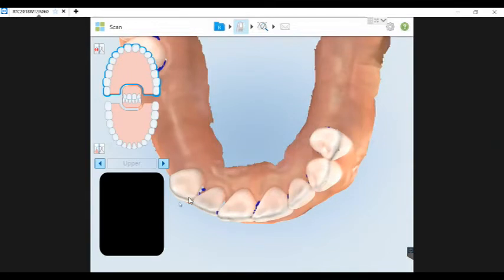Kelly, we've had a couple questions. Yeah, I hate to interrupt you. First question is, any tips on getting the mesials and distals between spaces where there are missing teeth? Yes, I'm going to show you right now, as a matter of fact.